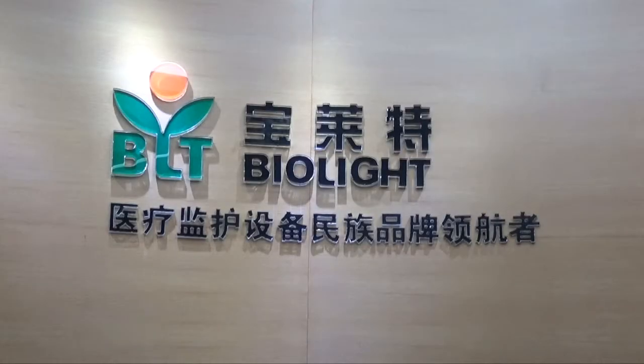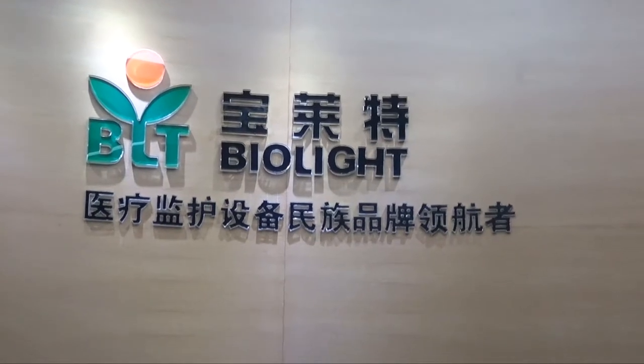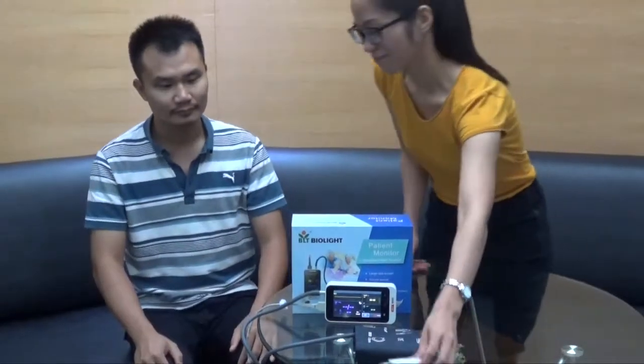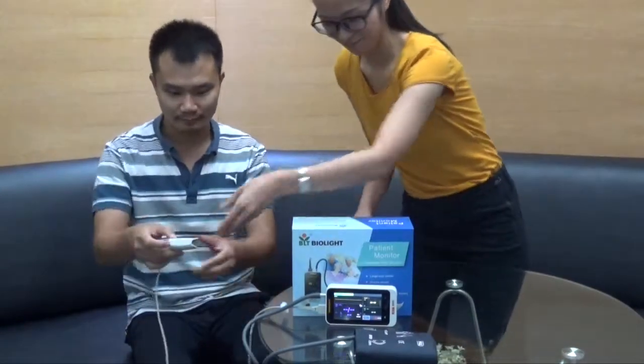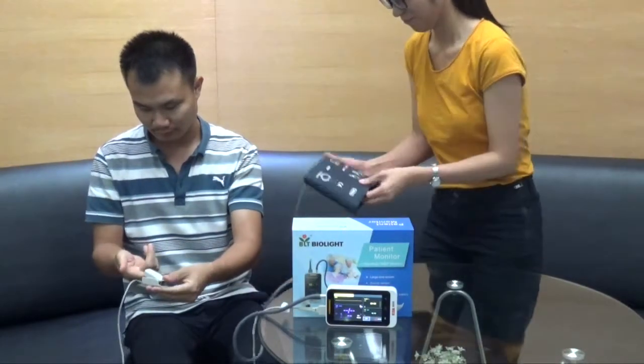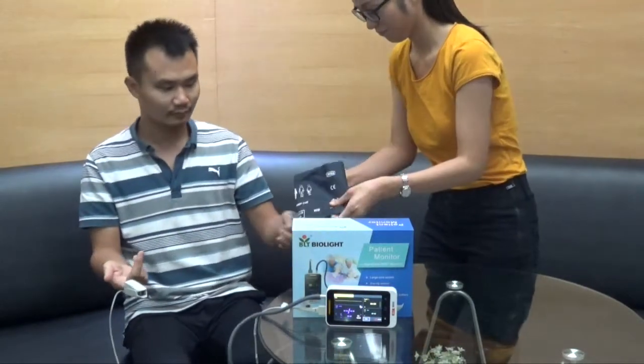Hello and welcome to the demonstration video for Biolight's M860 patient monitor series with NIBP and optional SpO2. Now I'll hand it over to Tim and Doris who will demonstrate how to use it. First, we turn the monitor on, connect the SpO2 monitor and the NIBP cuff.